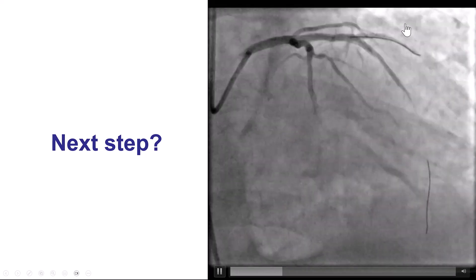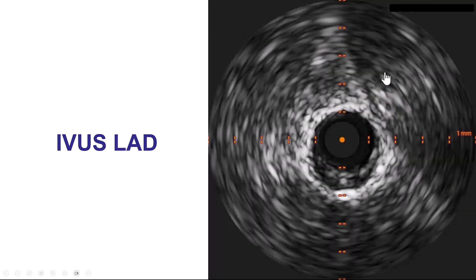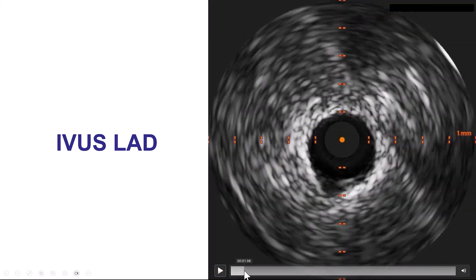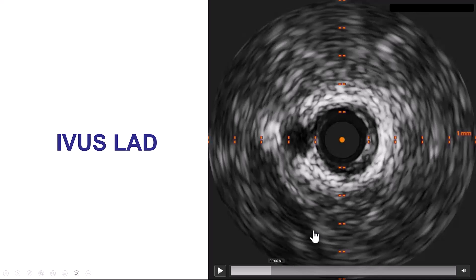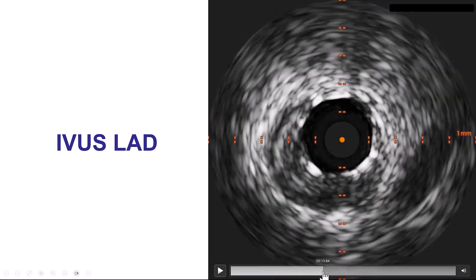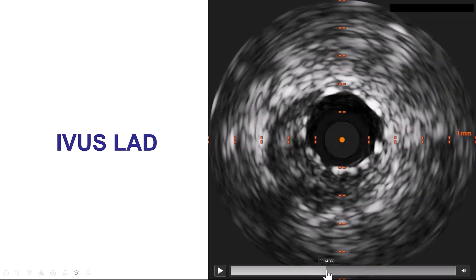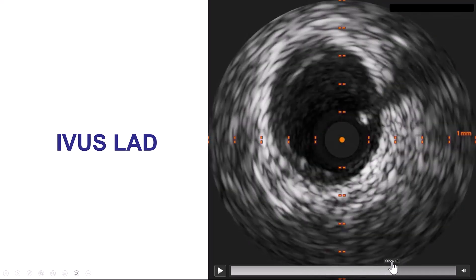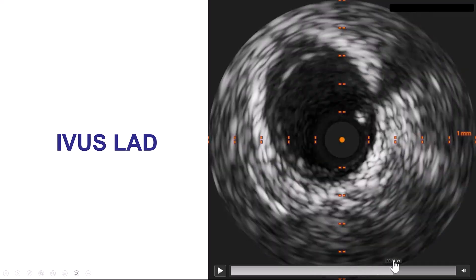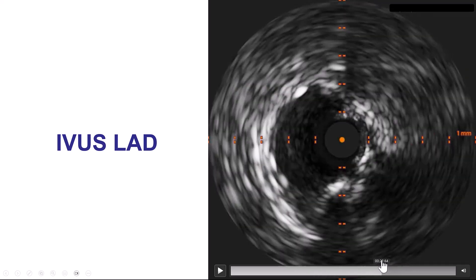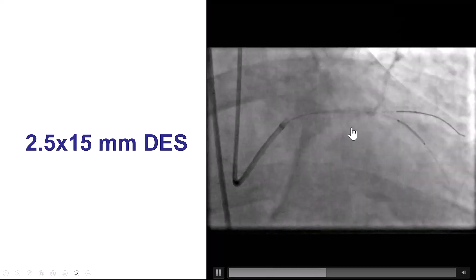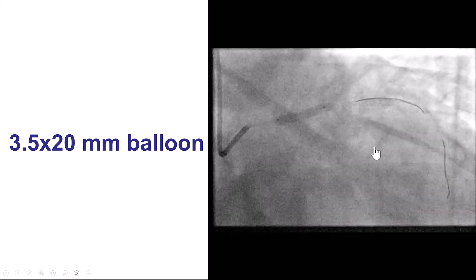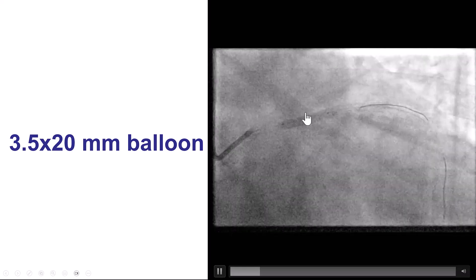The result seemed okay, although the stents didn't seem perfect in the proximal and mid-LAD. So we did IVUS again and saw that distally there was some residual disease not covered. We debated about covering that, and there was some stent under-expansion with significant proximal remodeling in the LAD. The stent extended essentially all the way to the ostium of the left main–LAD. So we placed another short stent distally and then post-dilated with a 3.5 mm balloon in the proximal LAD, which provided a nice result.